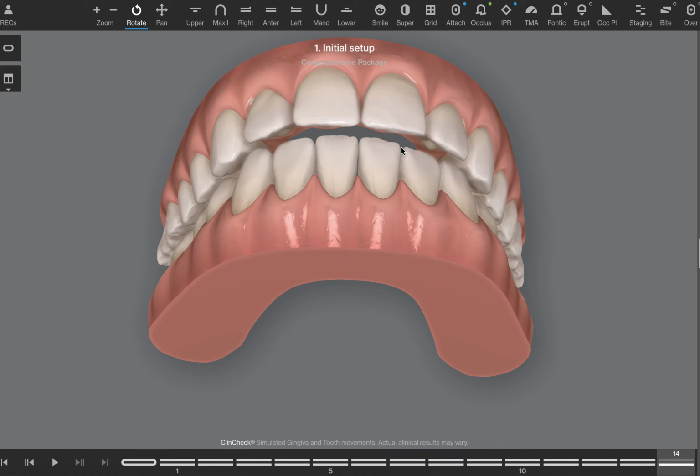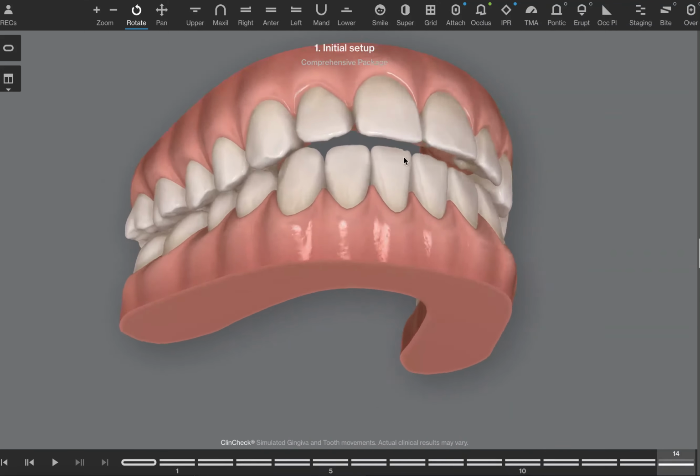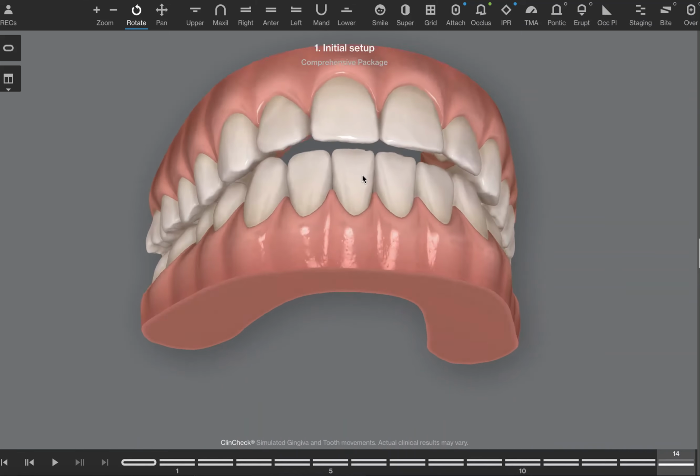Now, the important thing is we're going to watch to see what your lower jaw does as that happens. Most people, this starts to naturally close as your lower jaw starts to relax into a better position.